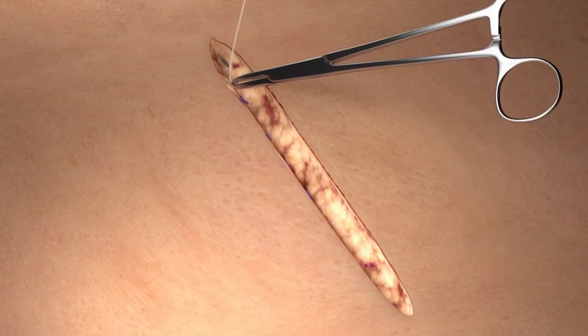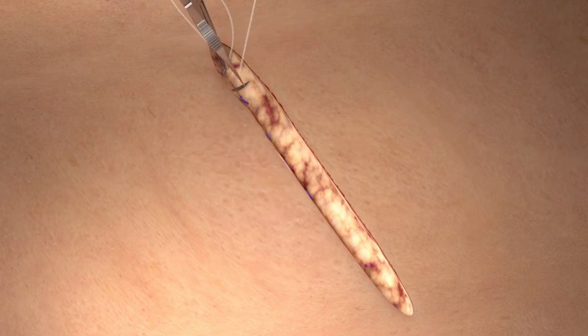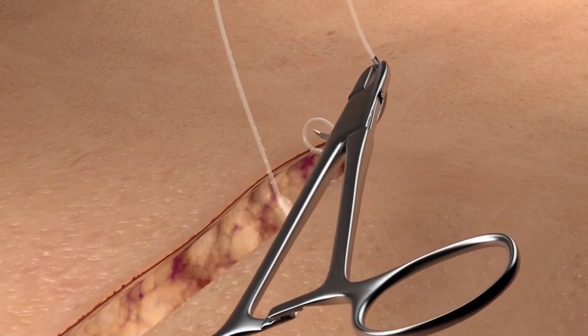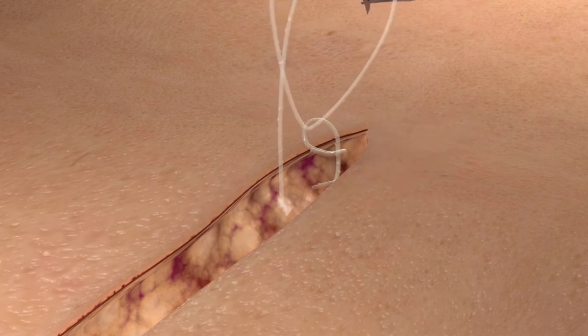Now that the deep dermis is approximated, we can close the superficial layer with the Quill monoderm device. Again, we begin by taking a bite of the designated anchoring tissue in the apex of the incision. Pass the needle through the variable loop and pole in order to tighten the loop and create the fixation point.